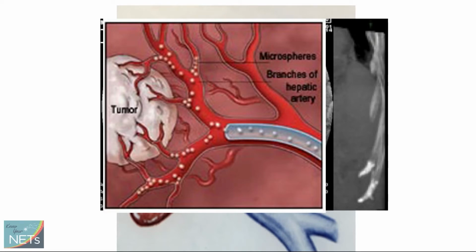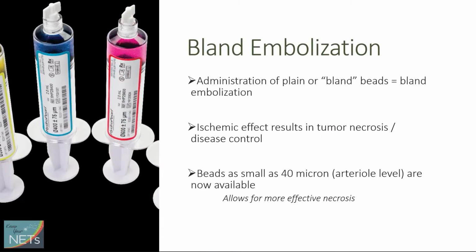Now that we're here, we can inject different types of things. If we inject chemotherapy, that's called chemoembolization. If we inject radiation beads, that's called radioembolization. And most frequently with NET patients, we inject something called just bland beads, or grains of particles, known as bland embolization.